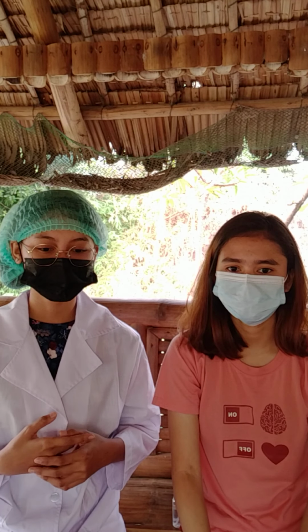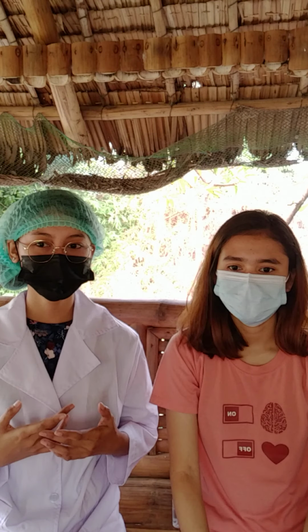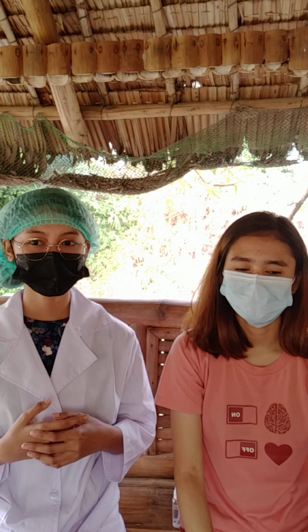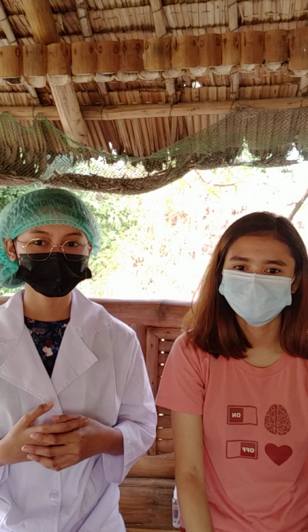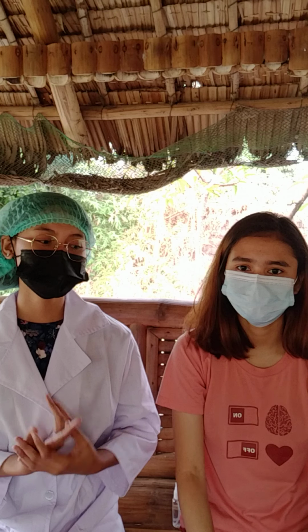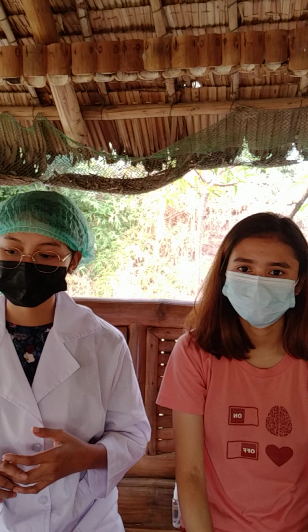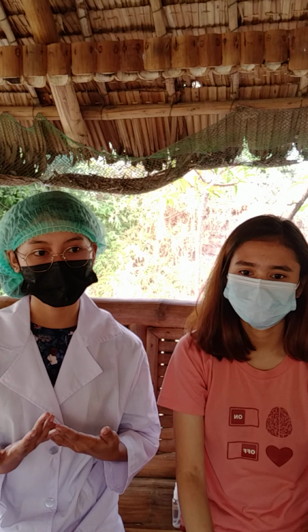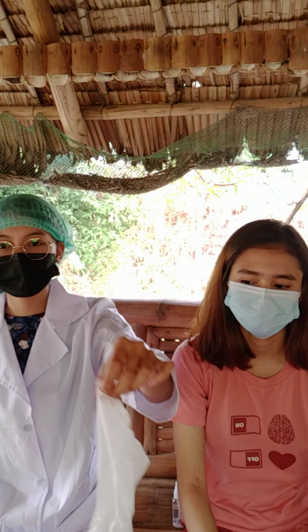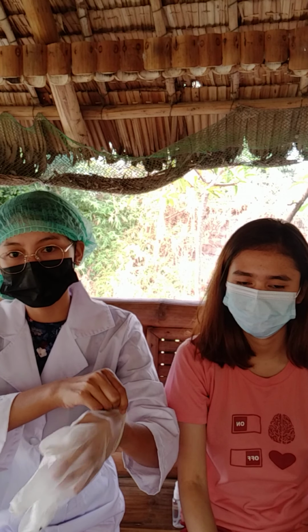And then after that, put on gloves to proceed to our assessment. So we have here one pair of non-sterile gloves.